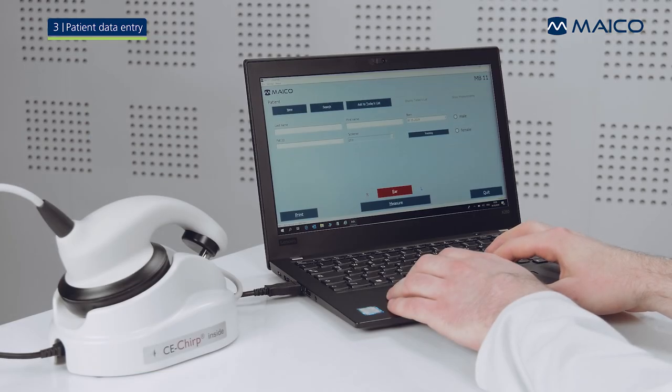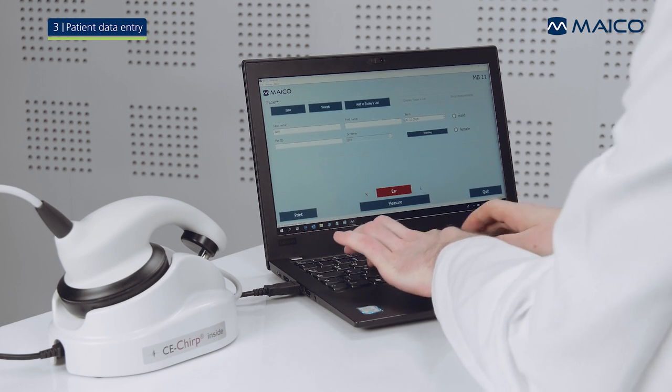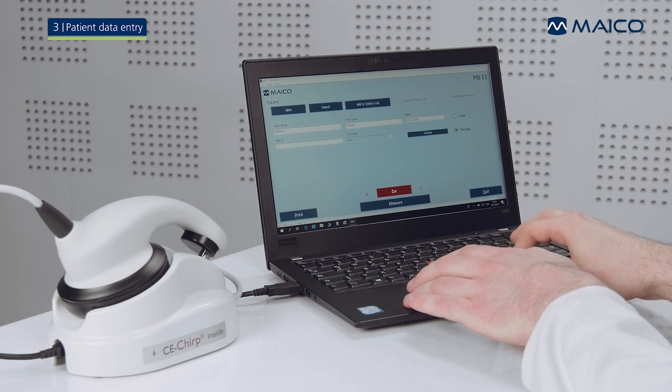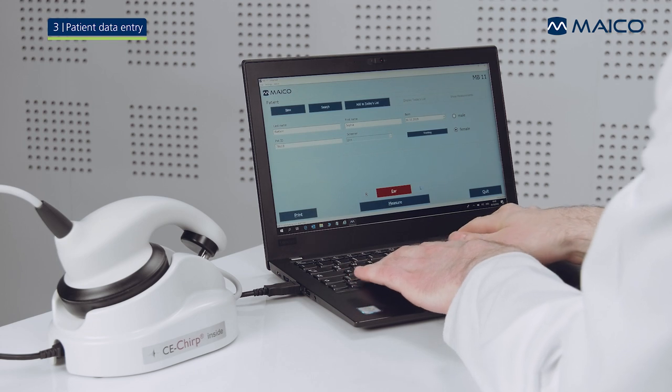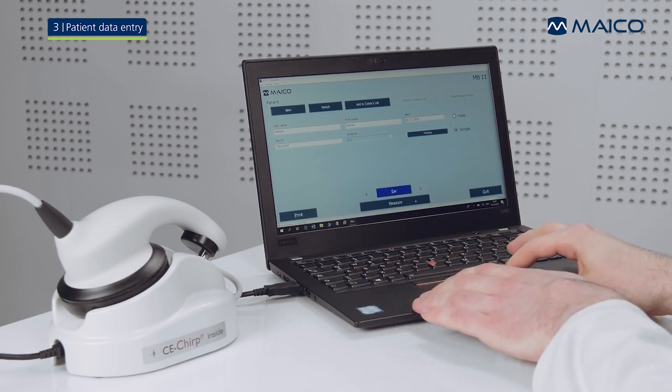Enter the patient information. Choose the ear you want to screen by clicking on the ear button. You can choose either right ear red or left ear blue.